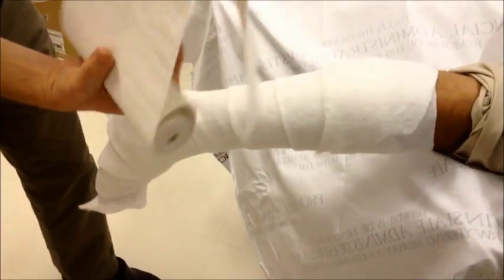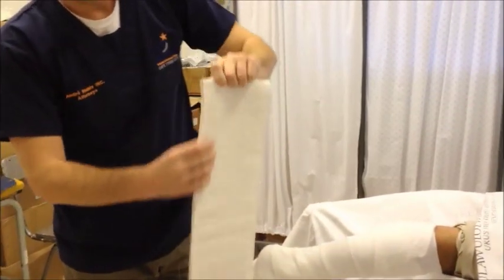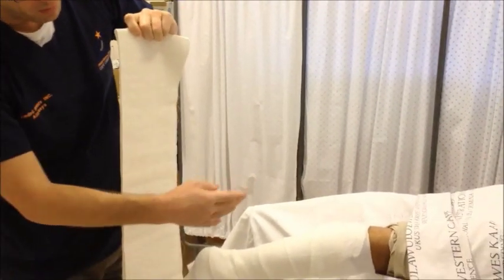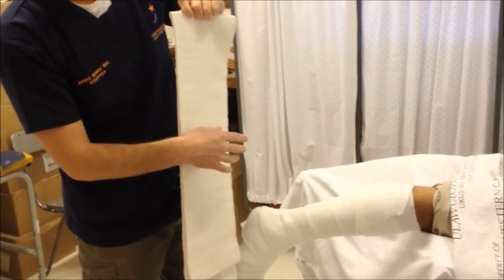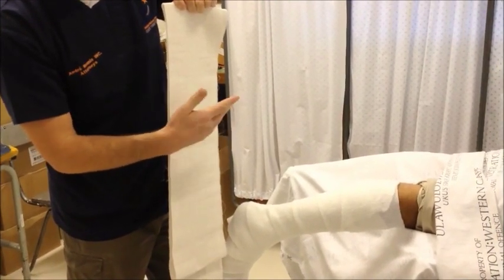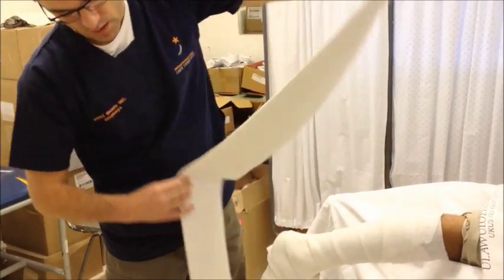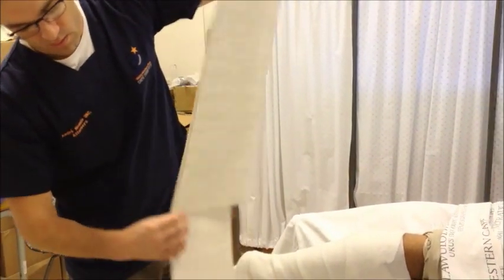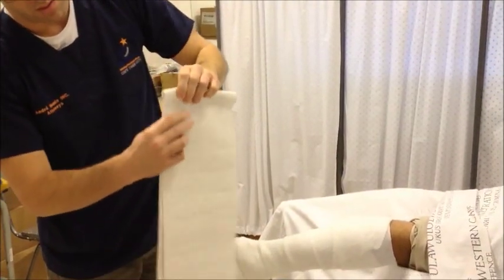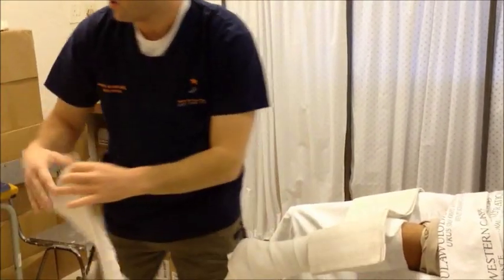There are many ways to roll this out. One simple way is to simply let it drop and to fold it. For a lower limb, we usually say ten layers plus or minus two for a below knee back slab, and twelve plus or minus two above the knee. Individualize it to how muscular your patient is, how long it's going to stay on, and what kind of control you need to achieve.